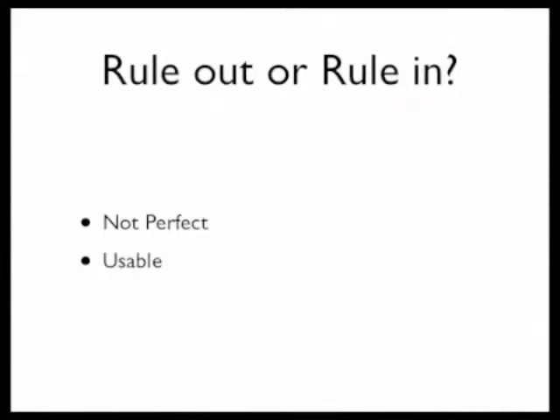Okay. No, I think those are very fair statements. However, I thought about this question, and I don't think I can pin it down to you can rule it out, you can't rule it out, you can rule it in. So what I did is I made an algorithm for myself. I thought about how I use this because I do use it. I told you about a patient earlier that I did send home with antibiotics. I felt epididymitis. They did not get a radiology ultrasound. They did not get a urology consult. So I did rule it out on that patient.